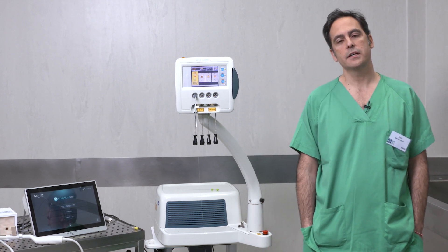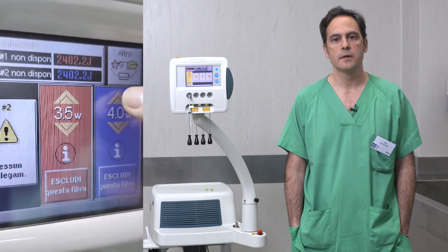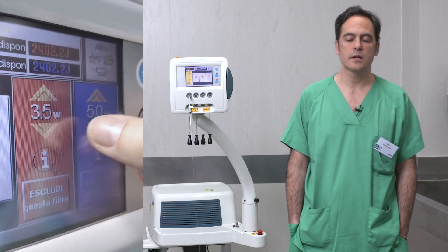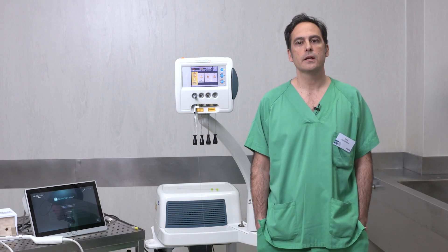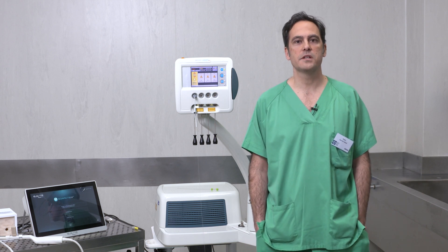Using Ecolaser you can apply low powers and low energies, up to 5 watts maximum and 1800 joules maximum per fiber. If you use Ecolaser treatment, you don't need general or spinal anesthesia — you can do it under local anesthesia in an ambulatory outpatient setting.